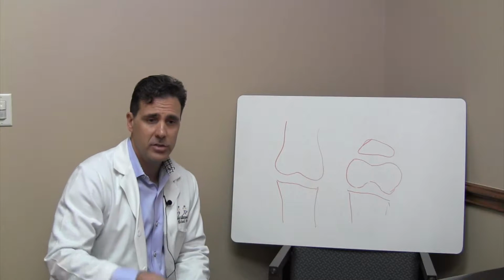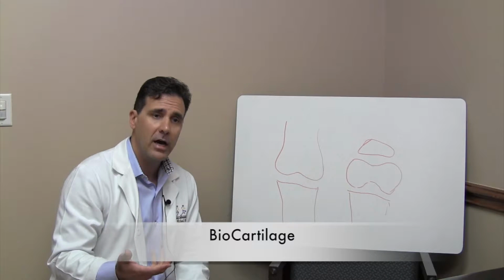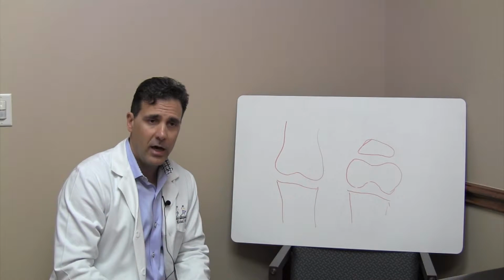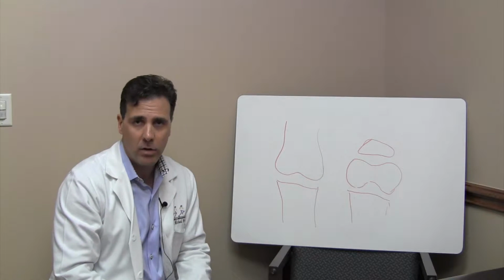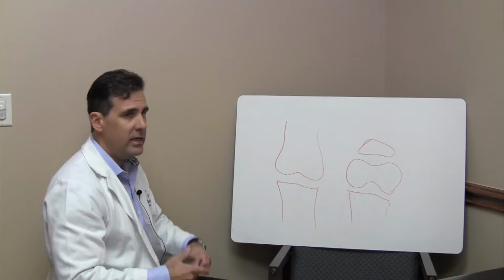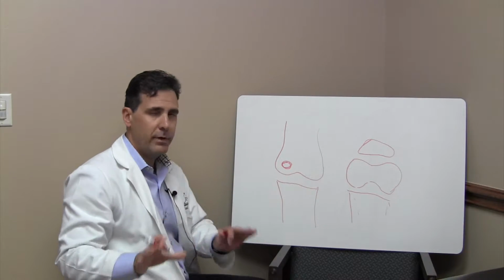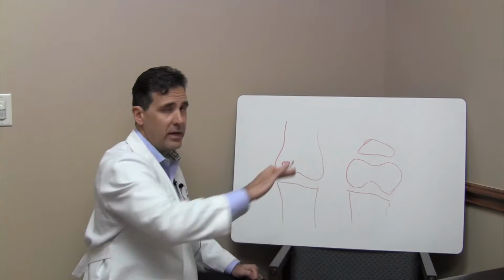And the idea is to stimulate new cartilage formation through using small microfracture holes in addition to using cadaver cartilage cells, which would help create an overlay of new cartilage-like healing over the defect. So if you look at a knee, basically you've got a defect of cartilage here, which is exposed bone. And there are certain patients that may be candidates for this. You can't do this in patients that have diffuse arthritis throughout the whole joint.